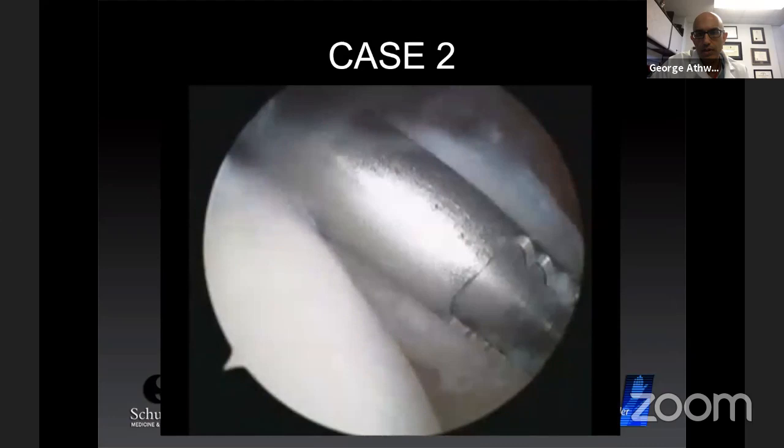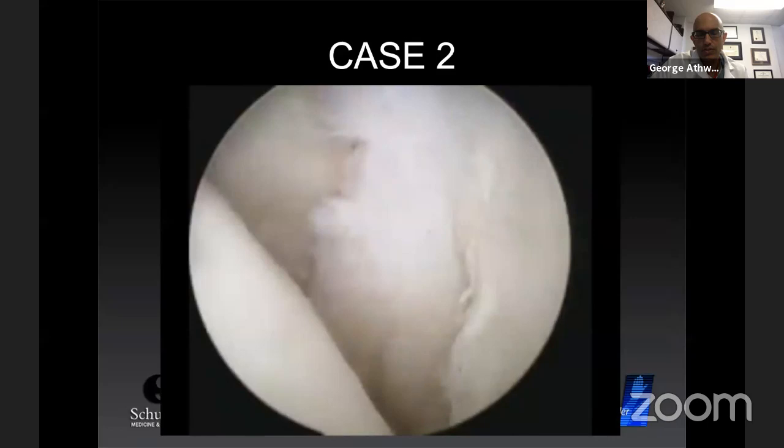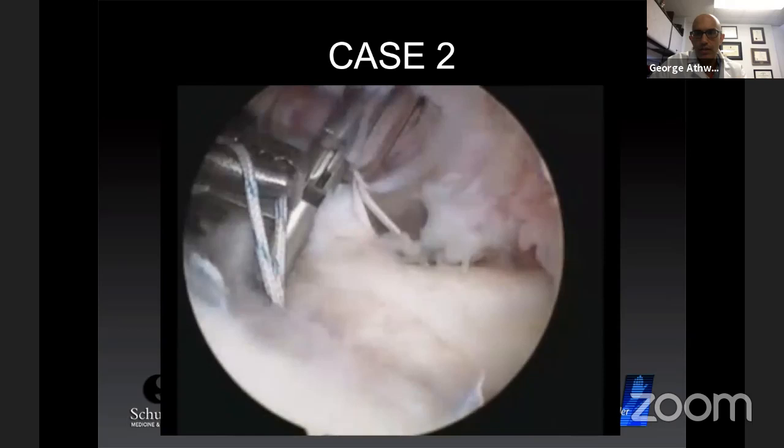So I'm going to go ahead and grab the upper edge of the subscapularis right there, pull it up, and you can see how it almost wants to inset right into the lesser tuberosity. So if you lift it up, you can inset it right into the tuberosity, just like so. And then once again, this will be a two anchor repair because it's the upper aspect of the subscapularis. I place my anchors inferior to superiorly, pass inferior to superiorly, and then tie superior to inferior.